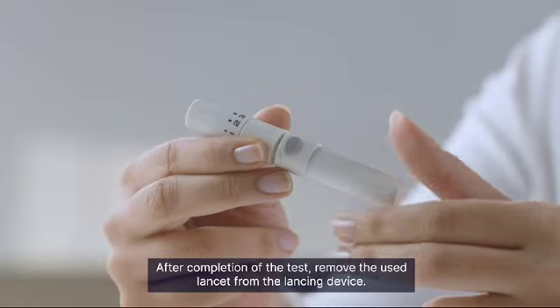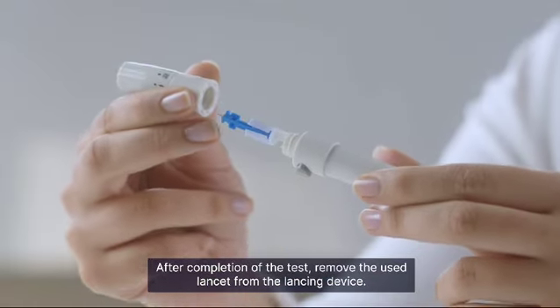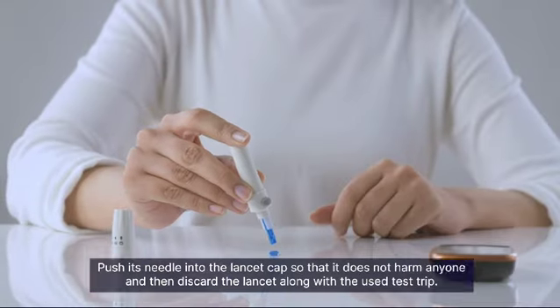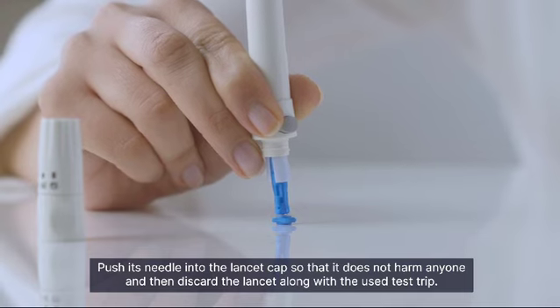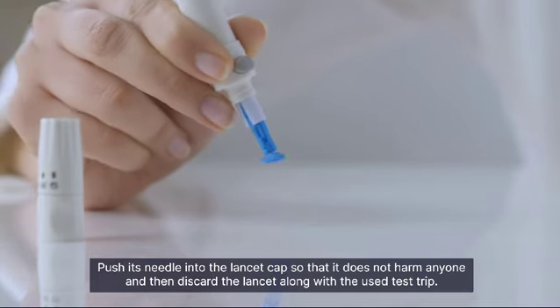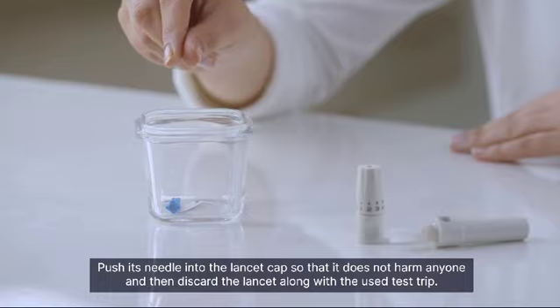After completion of the test, remove the used lancet from the lancing device. Push its needle into the lancet cap so that it does not harm anyone, and then discard the lancet along with the used test strip.